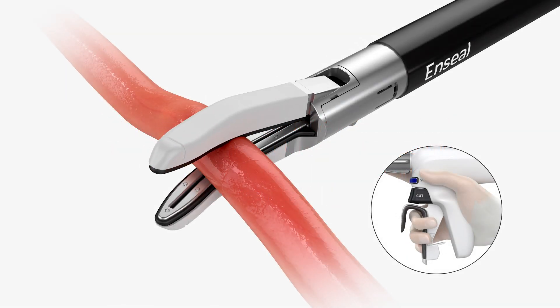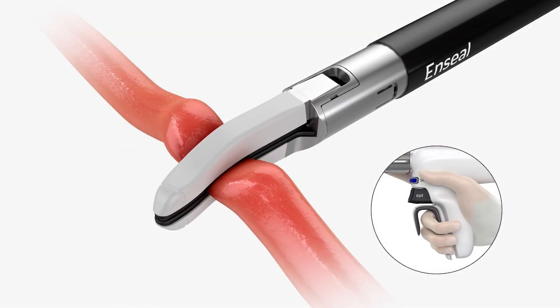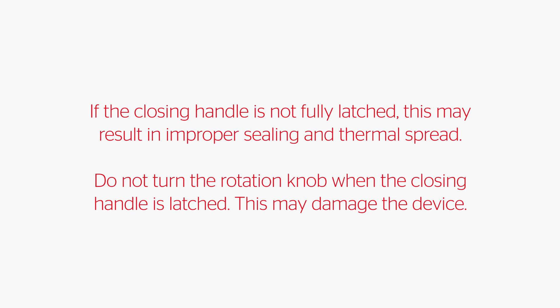This could result in difficulty opening the jaws, partially cutting tissue, and unintended injury. Squeeze the closing handle until it latches and a click is heard to clamp targeted tissue between the jaws. The instrument is now ready to seal. If the closing handle is not fully latched, this may result in improper sealing and thermal spread. Do not turn the rotation knob when the closing handle is latched, as this may damage the device.